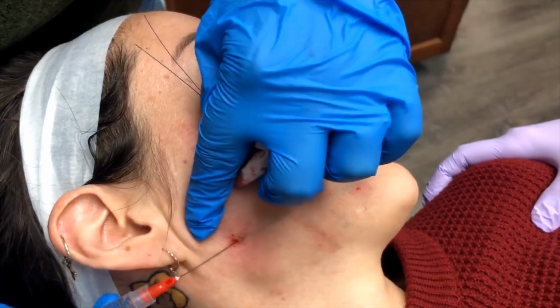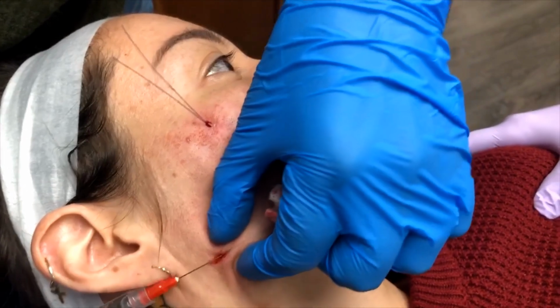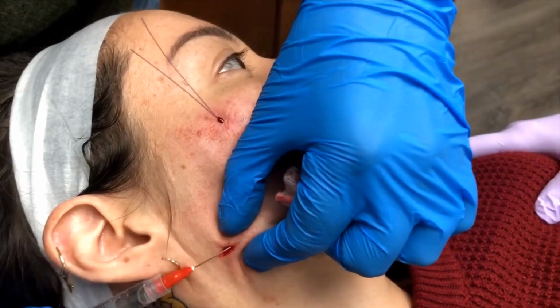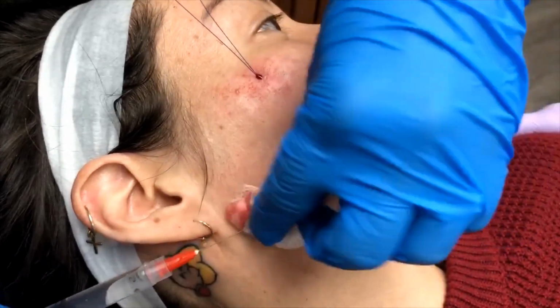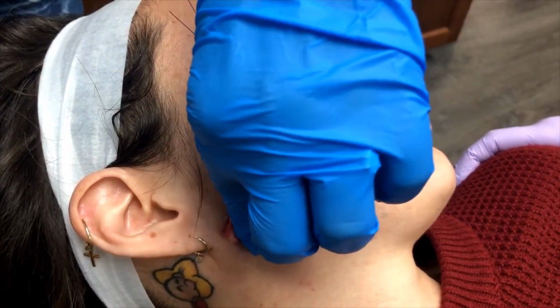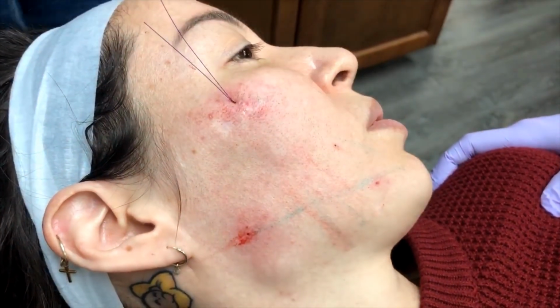Now, ComfortDocs microcannula, these are fairly easy in this plane, and you'll see that it is going to go straight to place there. We're going to go ahead and pull back on that and deliver some lidocaine 2% there. And now we are just ready to go for all of this.